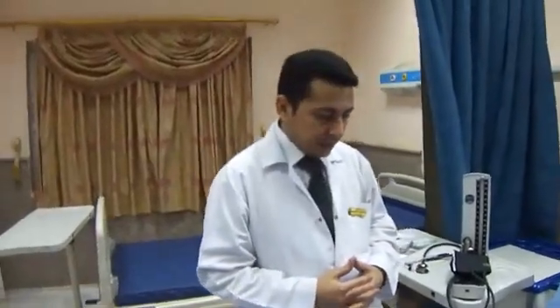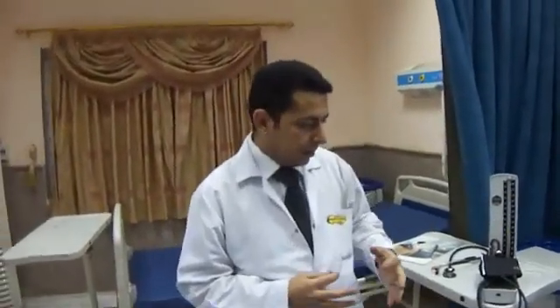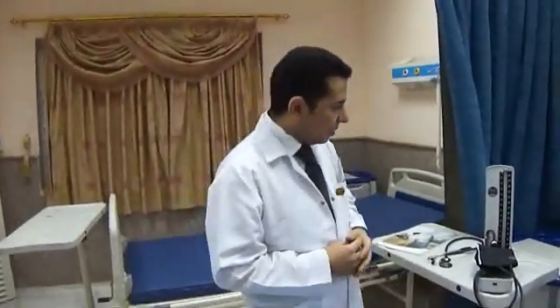Today we will show the examination of vital signs. The vital signs examination consists of blood pressure measurements, radial pulse assessment, respiratory rate assessment, temperature, and lastly pulse oximetry. We will show these measurements in sequence.